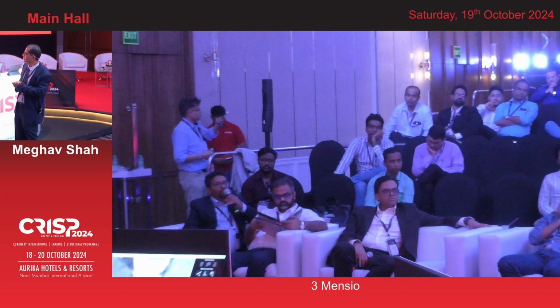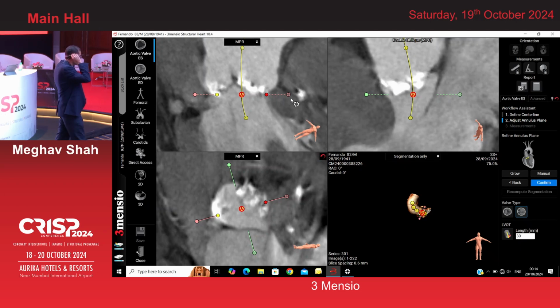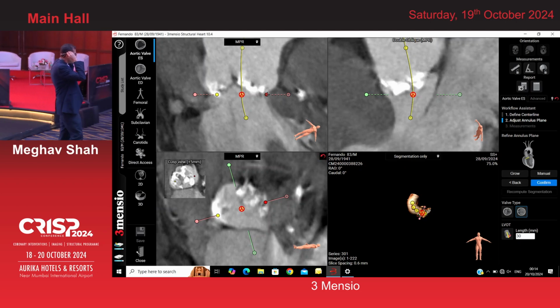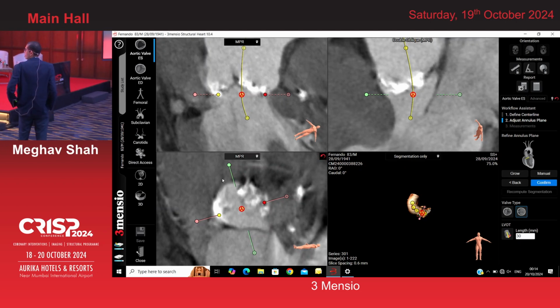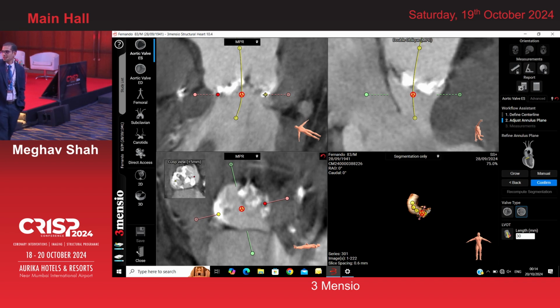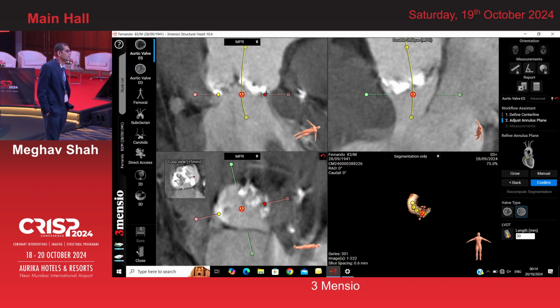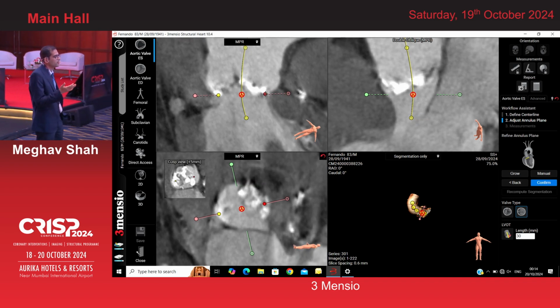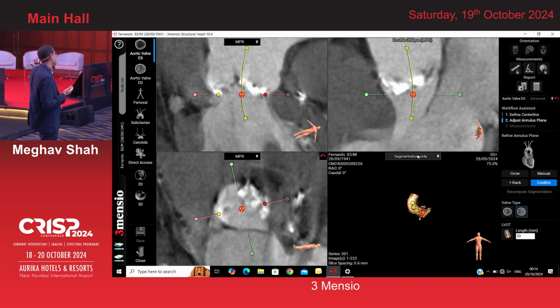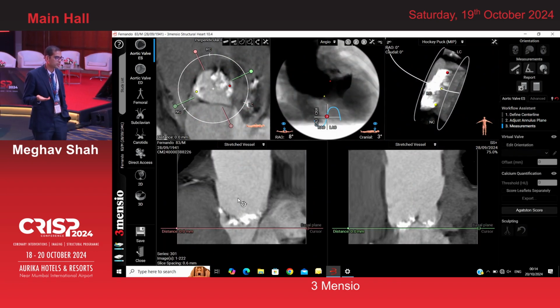So, yeah. Can you talk about something about sizing in bicuspids? Sizing in bicuspid? Yeah, that is very important. Okay. So, sizing of the valves. So basically, it's said that for tricuspid valves, if you use a self-expanding valve, you have to oversize by 20-25%, and for balloon expanding, 10 to 15% oversize.